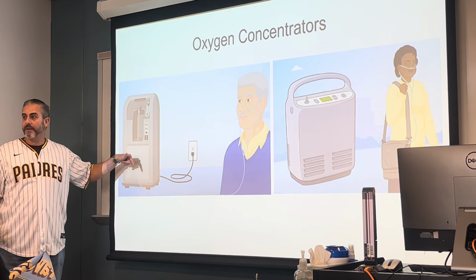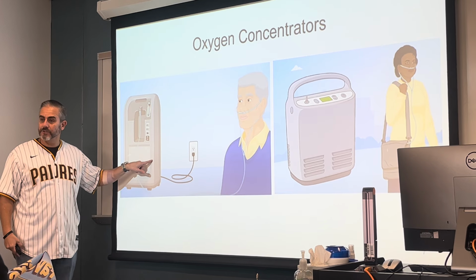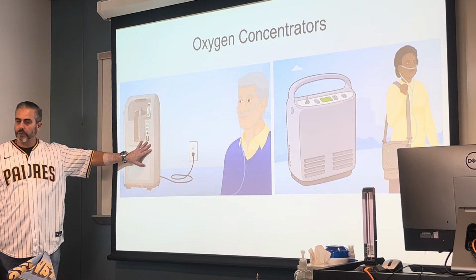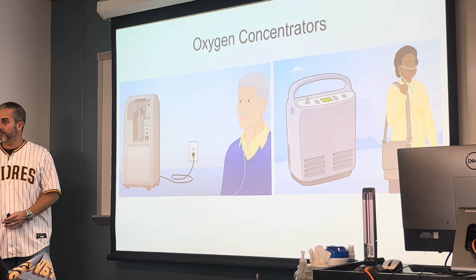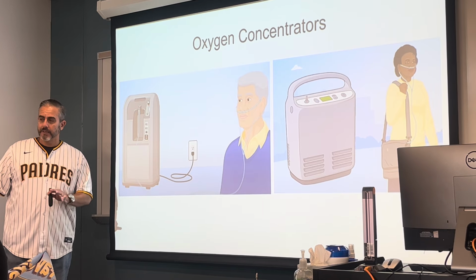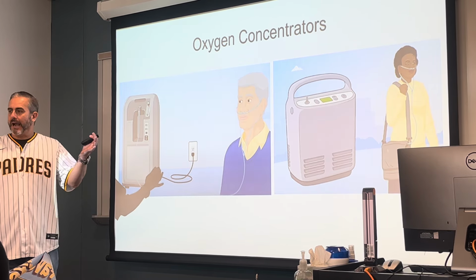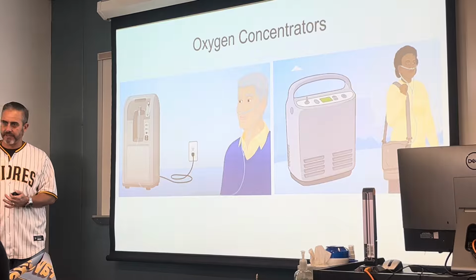What's going to happen to this patient? Well, this isn't going to work. This is not going to be able to supply the oxygen. So in a home care setting, sometimes patients that have this also have some backup tanks, just in case. Now those tanks, again, we'll talk about them, aren't going to last forever either. So if we're going to be out without power an hour or two, okay, no big deal. I can probably run a tank and that'll suffice.